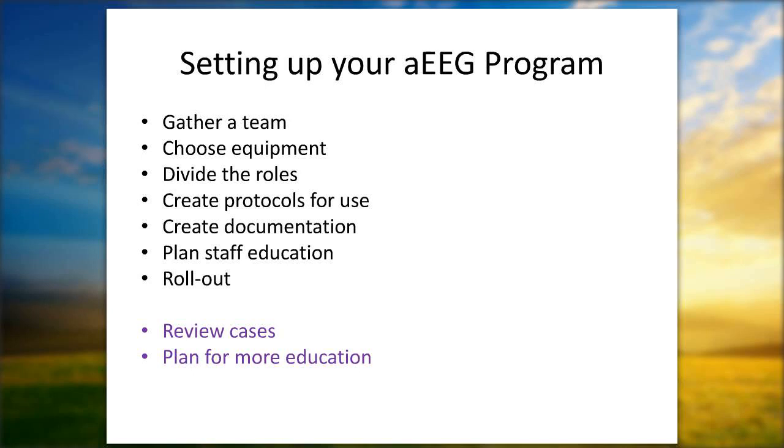And then finally, plan for more education. So I think at least a minimum of once a year with your annual refresher education that you offer for staff. Definitely as you onboard new staff, talk to them about what aEEG is, and maybe even, again, take these cases and post them so that people on all shifts, on weekends and everything, can see the way that aEEG is being used in your department.